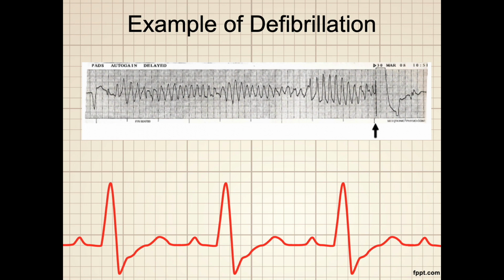You should know that the patient will be getting CPR before the defibrillatory shock. The shock should then be applied and CPR should immediately commence to assist the heart with circulation and to prevent the heart from suffering from an ischemic injury.